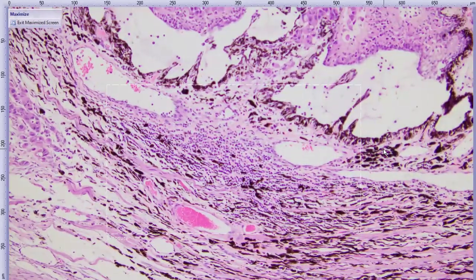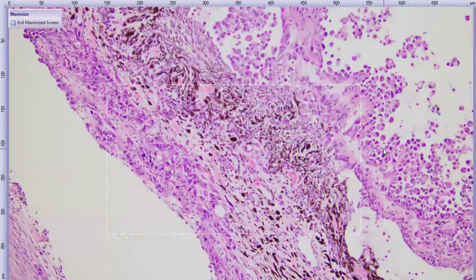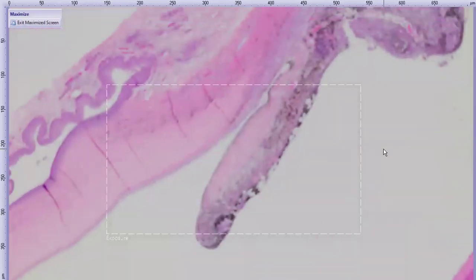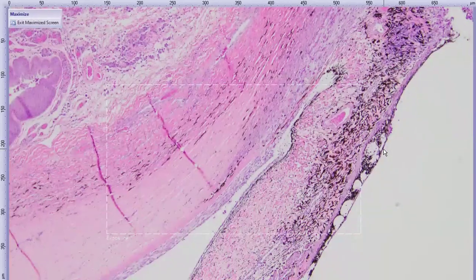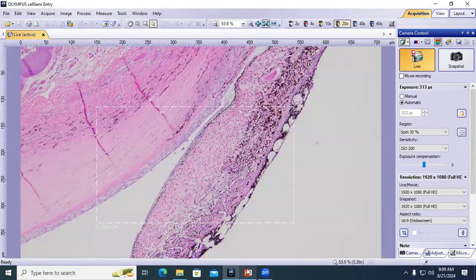Here are lymphocytes and plasma cells. So there is also a uveitis in this eye, as well as neoplasia, which is probably part of the reason why it presented as uveitis clinically. So just some interesting thoughts. The neoplastic cell is probably easier to see on this side, actually. For what it's worth, it also provoked the creation of fibrovascular membranes and synechia, which is something else that might clinically, if you have rubeosis iridis or something like that, make you think uveitis, but there could be something else going on. So an interesting case that we can learn from, and that's all I have for this one.